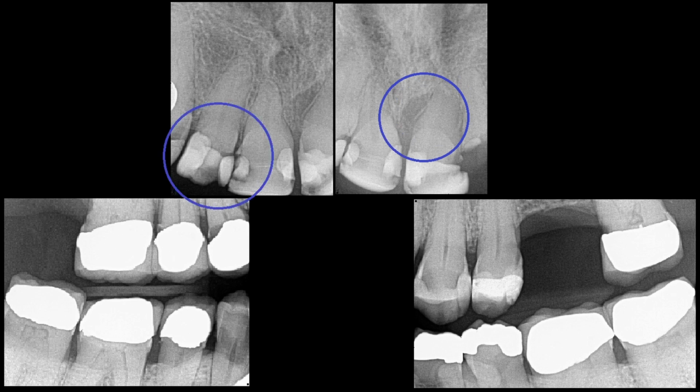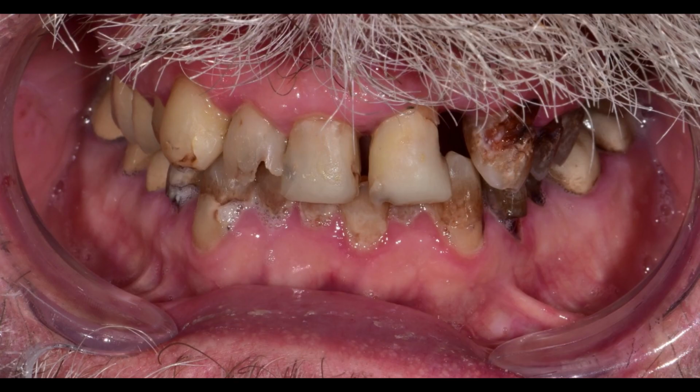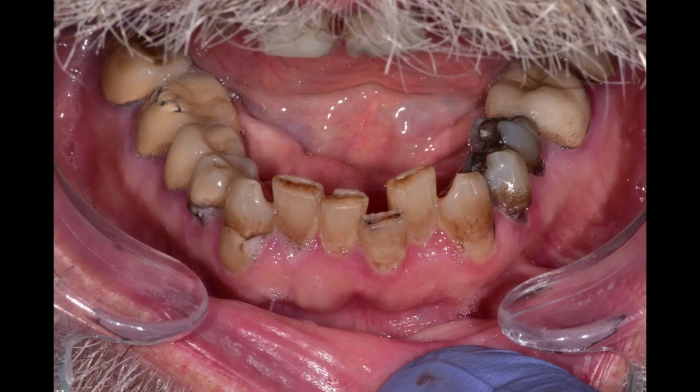We can also see some recurrent decay under his upper anteriors and some more under his upper first premolar crown. Clinically, we can see there's a bunch of class 5 decay under his canines and premolars. So patient hadn't been to the dentist in quite some time and wanted us to come up with a plan to get him out of pain, take care of his cavities, and get his front teeth functional and aesthetic again.